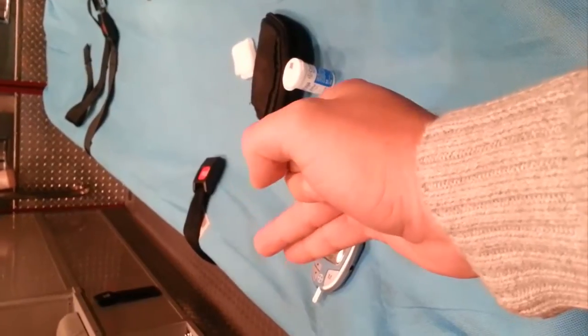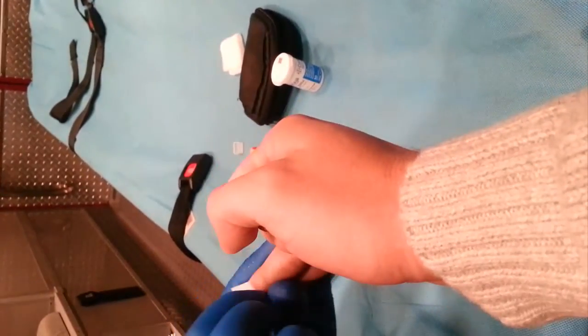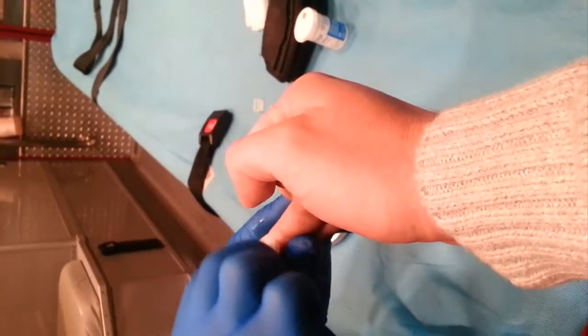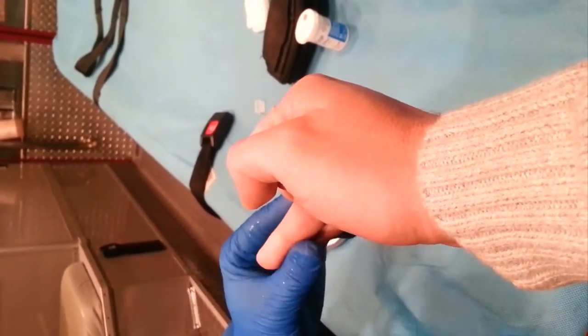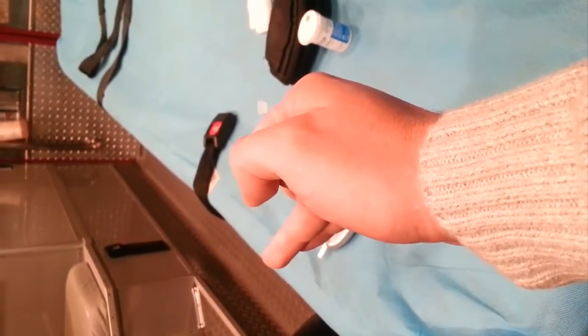So we recommend coming in here and going for the ring finger. Note he's swabbing the side of the finger and not the pad where I'm going to be picking stuff up. Makes it a lot easier for the patients.